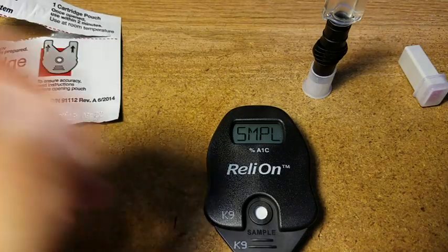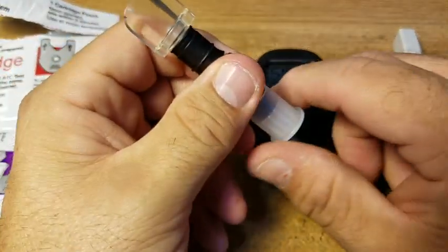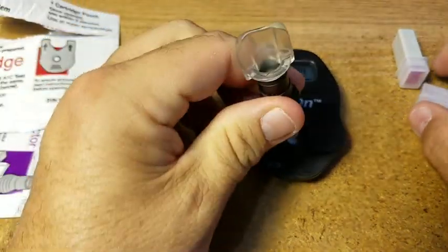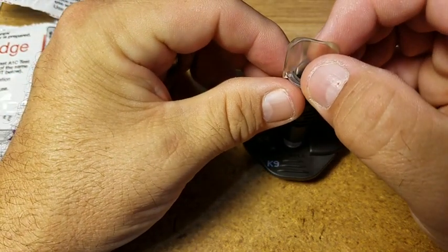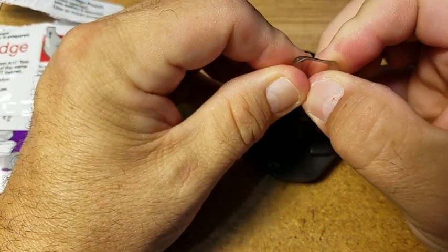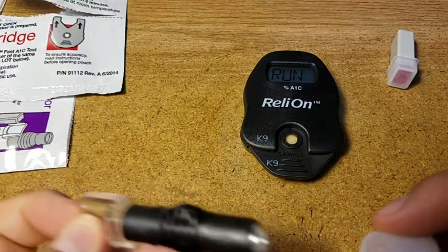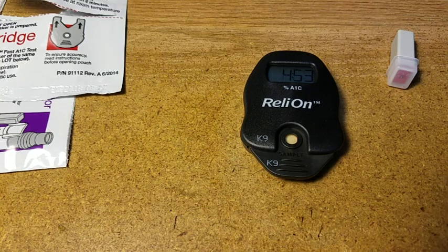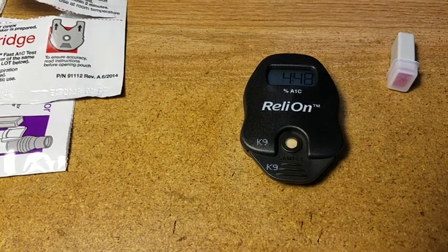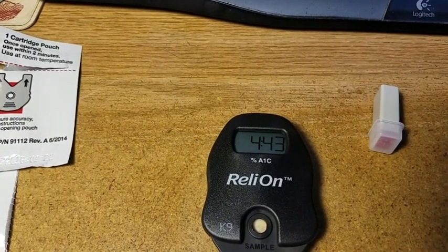Then it'll say 'sample' when it's ready — and it's ready. We're just going to give it a sharp, quick jab on the sample thing here. We're going to have to leave this alone while it's running. Let me pull the cap off and deliver the sample — sample's delivered in about one second. So there we go. Now we just have to wait about five minutes.